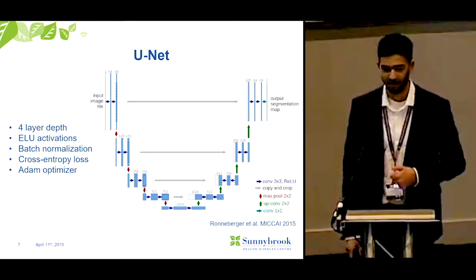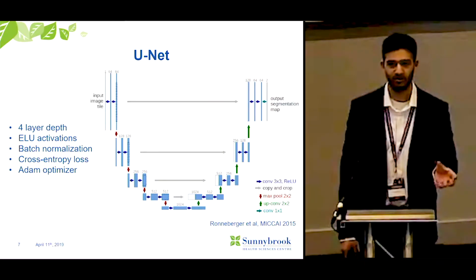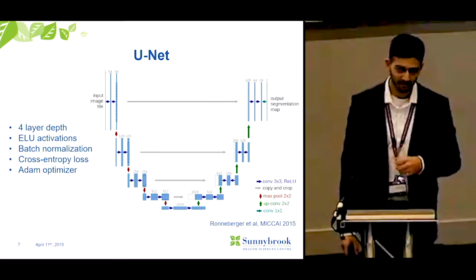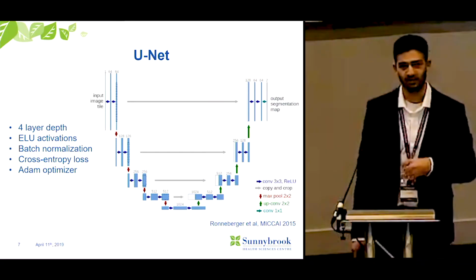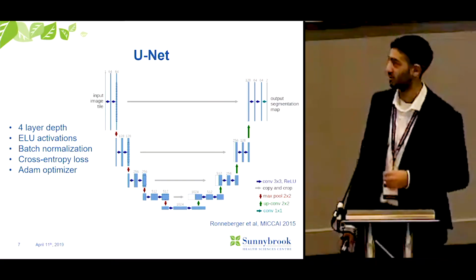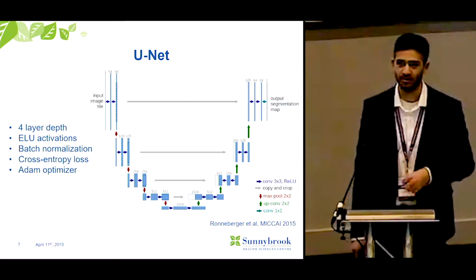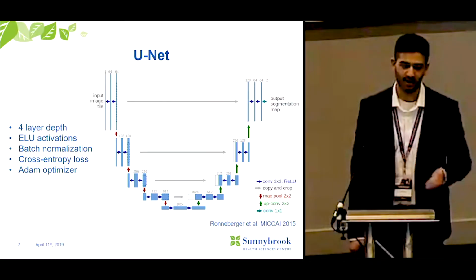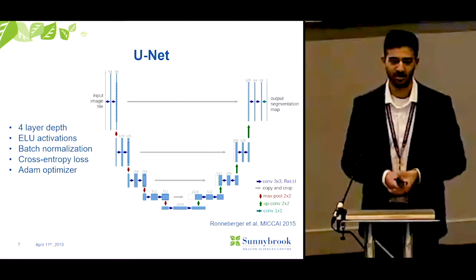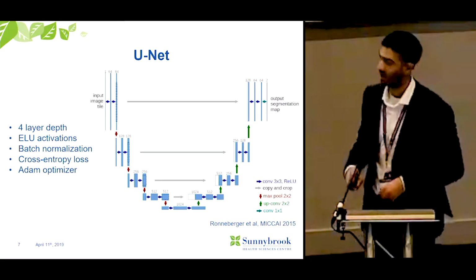image. And then the network starts doing a convolution, up-convolution sequence of operations, and at the end of each of those you concatenate the feature maps of the equivalent size from the downsampling arm with your new set of feature maps in order to preserve spatial information. You perform that sequence of operations over and over again until you reach the original size, and you get an output segmentation map, which is just a probability of whether each pixel in the image is DCIS.